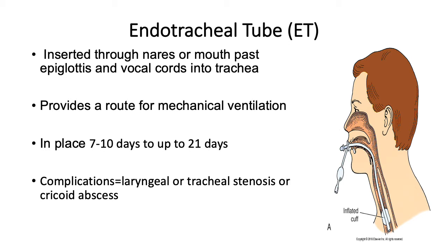It provides a route for mechanical ventilation in patients who need that type of respiratory support. There's controversy as to how long it should stay in place. It's usually anywhere between 7 to 10 days up to 21 days. Some of the possible complications are laryngeal or tracheal stenosis or cricoid abscess.